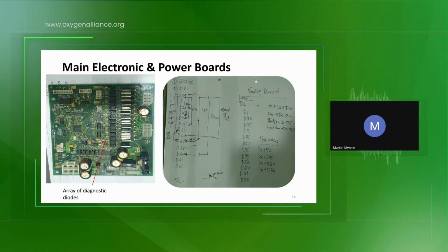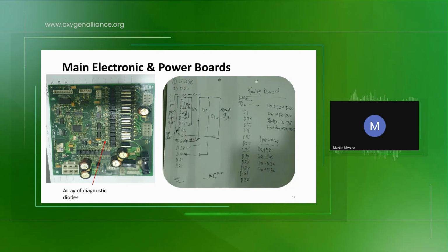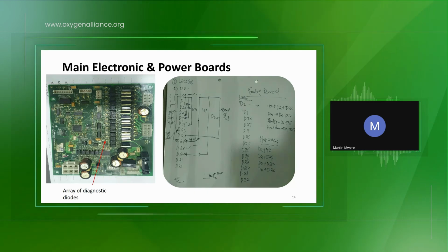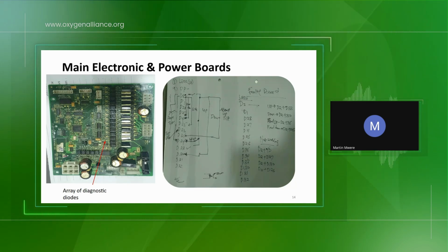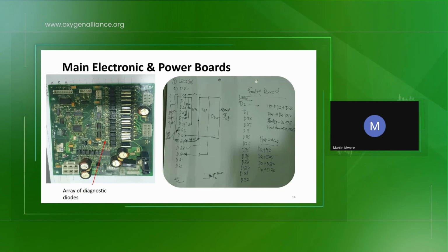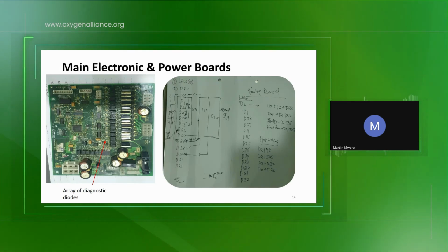Is it 5 volts? Is it 7 volts? And then you check within your electronics that supply. Once you attain that 7 volts or 5 volts to these particular diodes, then you'll achieve the other remaining 4 movements of that chair. So this was just from my practical experience, so I had to come up with such a drawing.